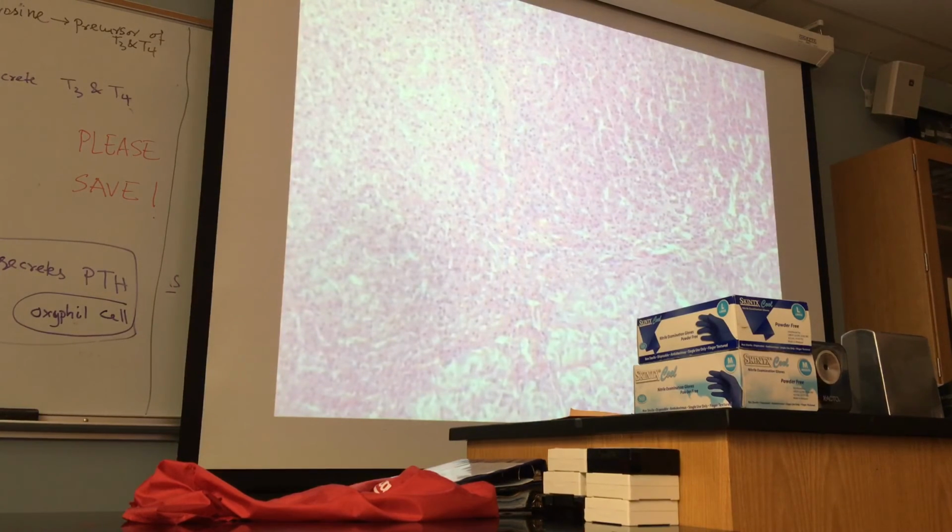Now, read the question properly. If I ask you, identify the gland, be specific. What are you going to write? Very good. Adrenal cortex. Don't write zona fasciculata. Zona fasciculata is a part of adrenal cortex. So identify the gland here, be specific: adrenal medulla. But if I ask you to identify the gland, without being specific, you can write adrenal gland. This is adrenal cortex, from here up to glomerulosa. Have you taken down the relevant information that I gave you?